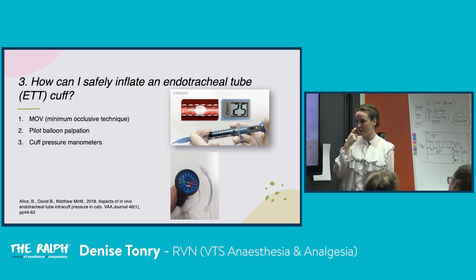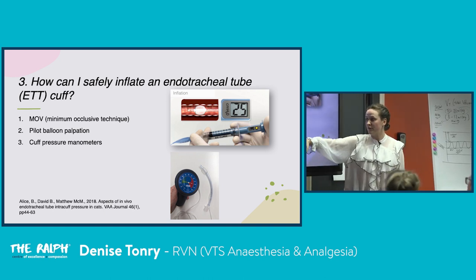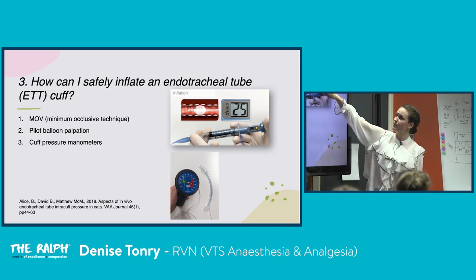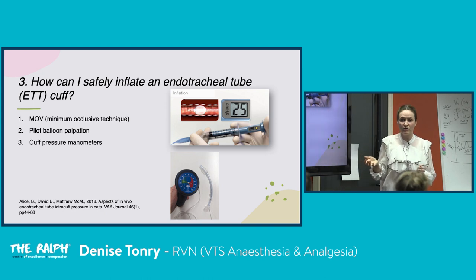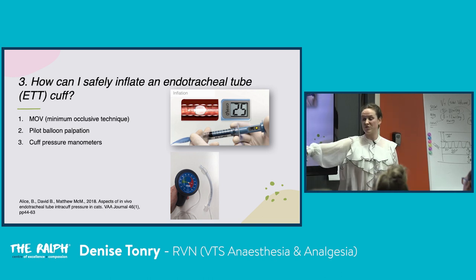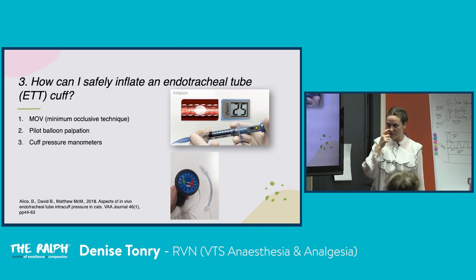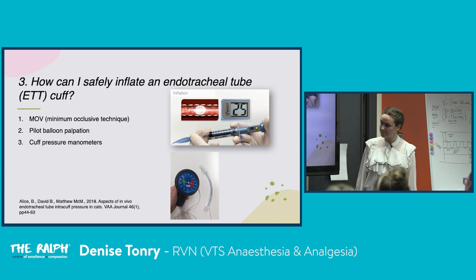They're on the side if anyone wants to have a look at them. And this, I would argue, is far superior, simply because these do the job, but they only have 100 uses. But they're about £12, so generally people can get like 10 of them into a practice, and 100 uses is better than none at all. These are around £120, so it's a bit harder to get them in sometimes, to get people convinced about their use, but obviously their use is never ending. They never run out of battery.